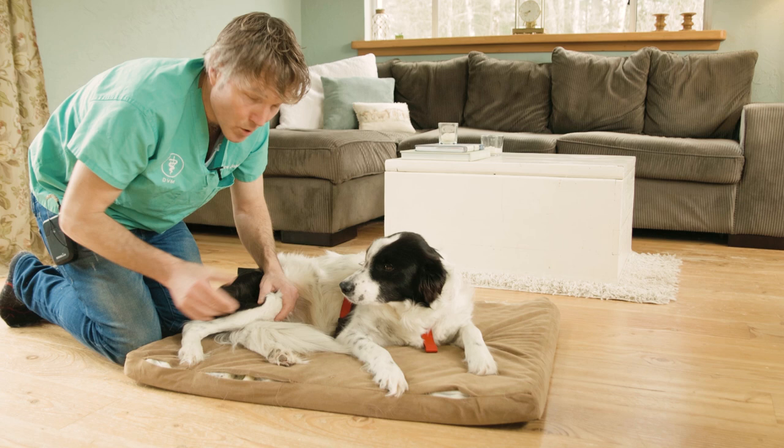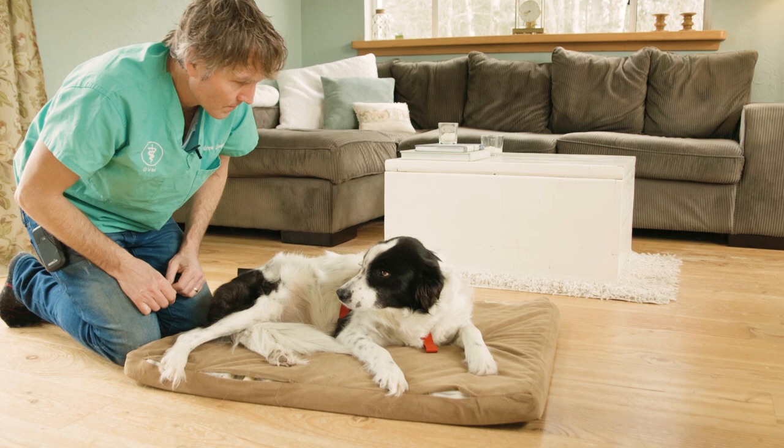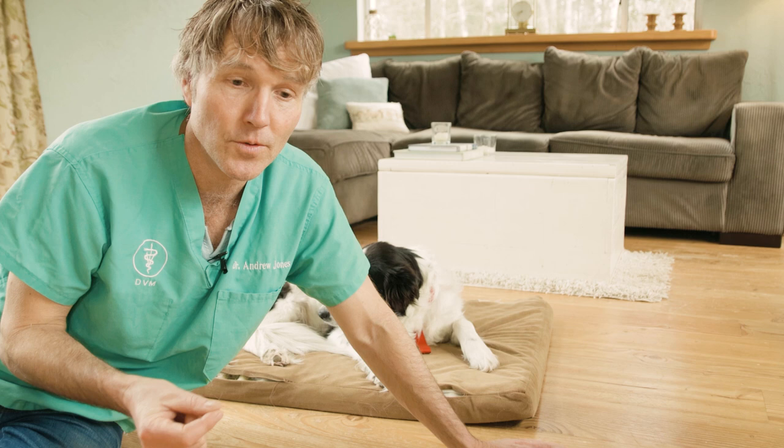To summarize: first, get an ACL support brace for your dog — the Ortho Dog brace is a great option. Second, provide good pain control — initially anti-inflammatories if needed, 95% curcumin, boswellia, CBD. Really make sure your dog is comfortable and as pain-free as possible, and start using that leg in a supportive way.